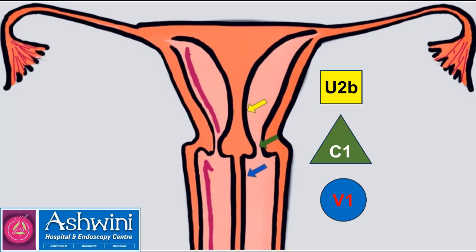Good evening friends. This video is in continuation of the part 2 video where we demonstrated the surgery for the longitudinal vaginal septum. The given slide shows you the anomaly with which we are dealing. So we have cut the vaginal septum. Now we have come to the cervical septum.